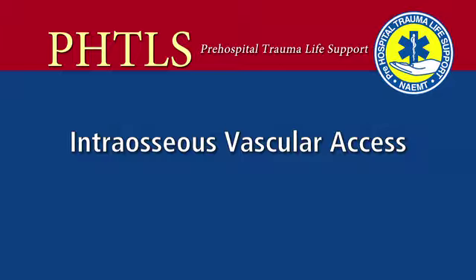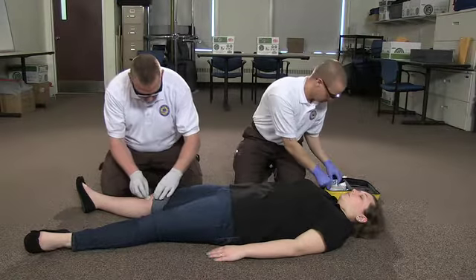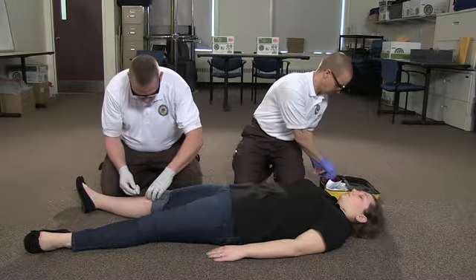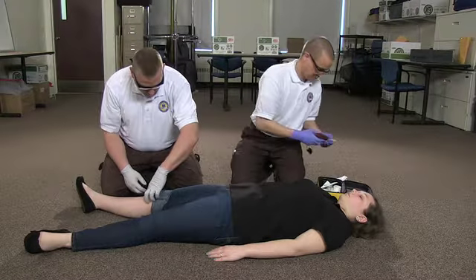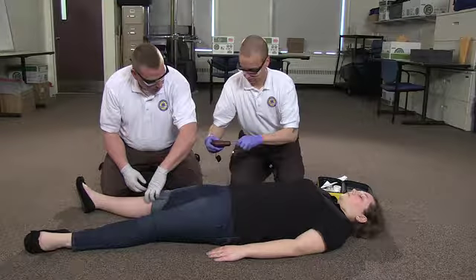Intraosseous vascular access. This video will demonstrate how to establish intraosseous vascular access. This technique may be performed on both adult and pediatric patients using a variety of commercially available devices.